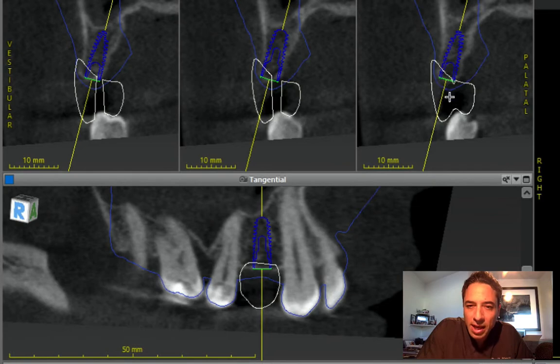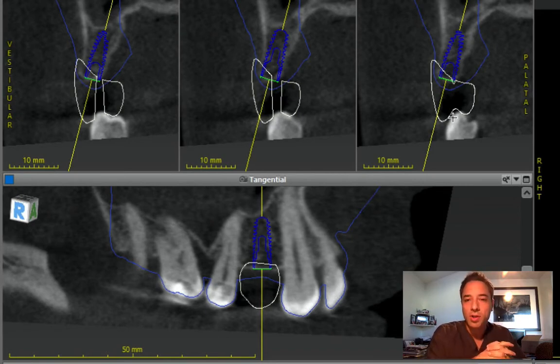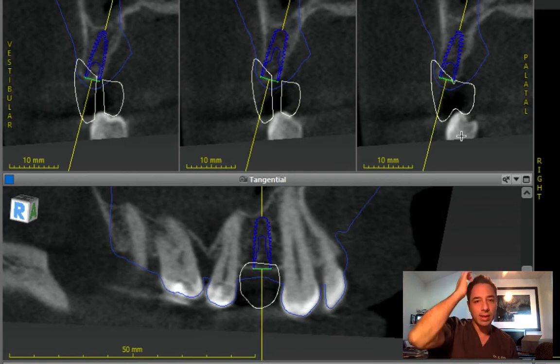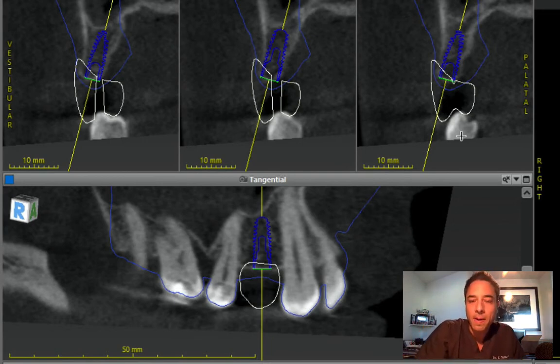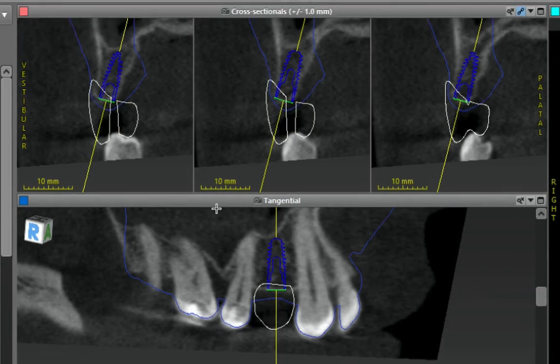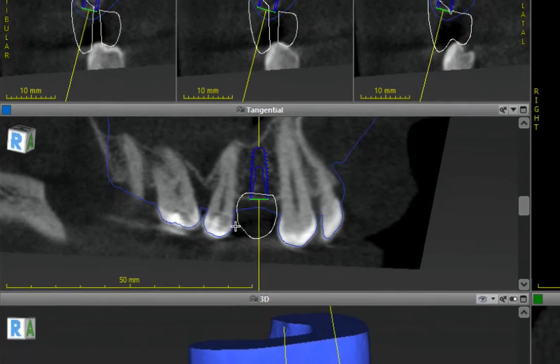But you'll still have to use a cementable restoration. Or you can use a tilted screw technology that will allow you to create a screw access restoration by using the tilted screw. But I think you're dealing with a deficient ridge, and I think this is the best one can do.